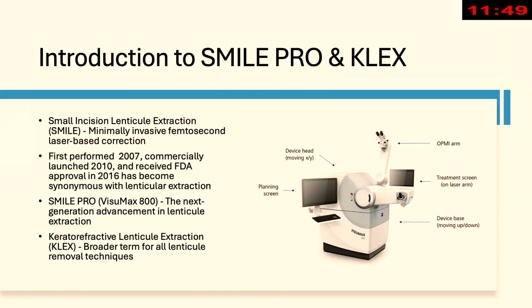As the previous speaker has already done some of the heavy lifting in terms of explaining what Smile is, which has for a long time, up until recently, become synonymous with any lenticular extraction technique, that's really the history behind the procedure. And Smile Pro is, I guess, the next generation in this lenticular extraction technique.